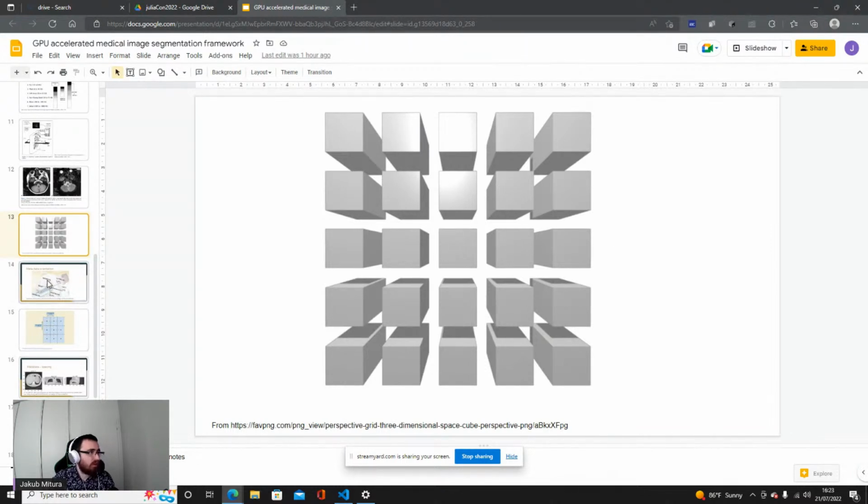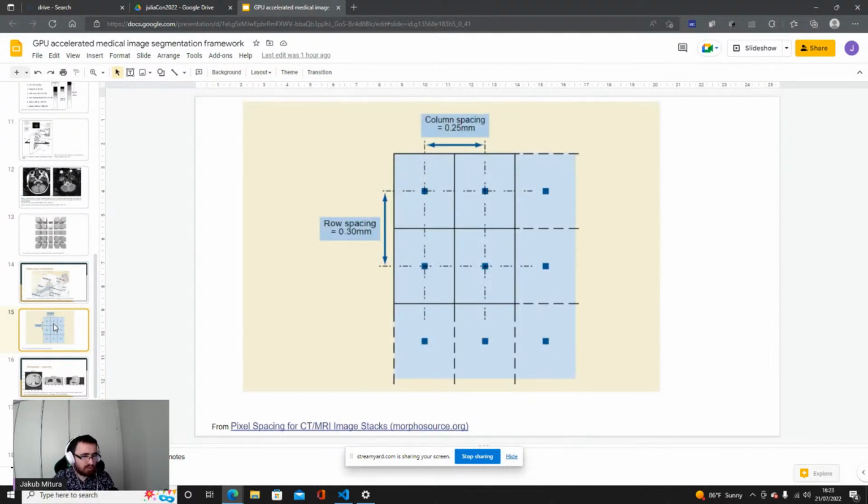In medical imaging, that's not always the case. The voxels have some dimensions in millimeters, so they can be tall and thin, or more square.